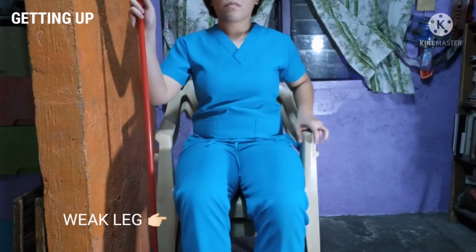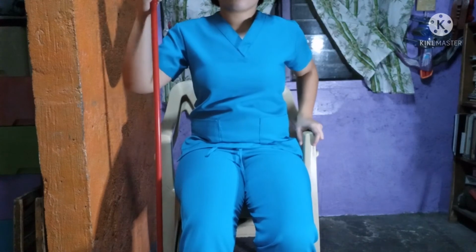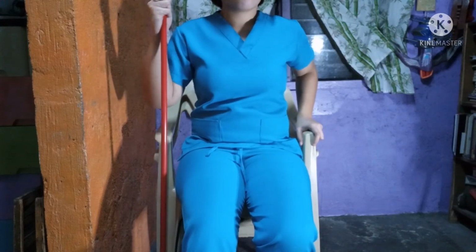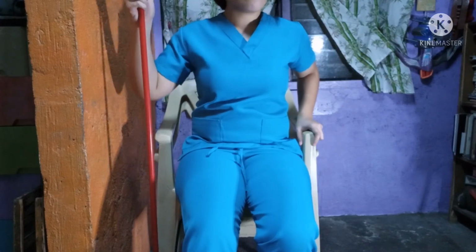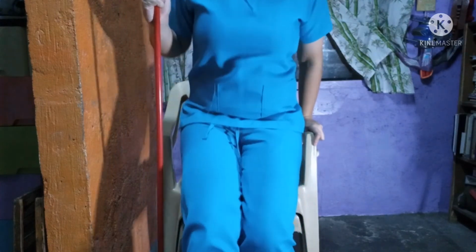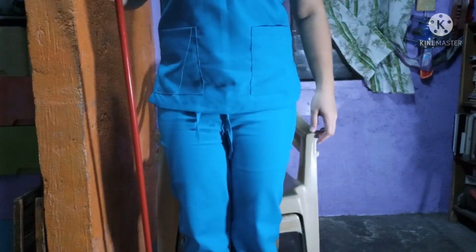In getting up, the patient will place the cane on the strong side and keep the weak leg slightly extended out. Then the patient will lean forward out of the chair and push down on the cane's hand grip and chair's armrest. Then the patient will put weight on the strong leg and stand in position with the cane.